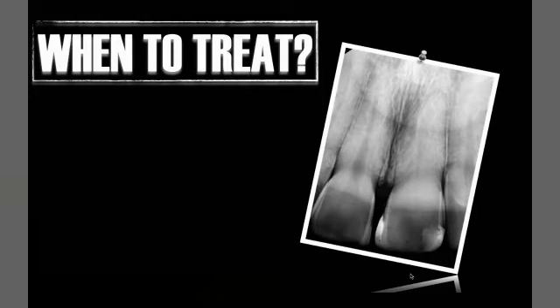And have you never used alcohol just to dry the pulpal floor? Yes, it's very useful to use alcohol, but actually I don't need it because I can dry it with air enough, and it's more than enough to dry it with air completely, and you will see the difference in the color.